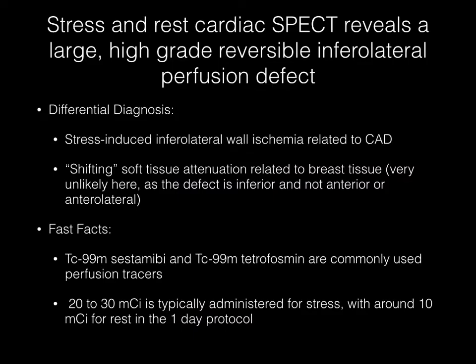Stress and rest cardiac SPECT reveals a large, high-grade, reversible inferolateral perfusion defect. Your differential diagnosis should include stress-induced inferolateral wall ischemia related to CAD. A less likely diagnosis would be shifting soft tissue attenuation related to breast tissue. Here, the defect is inferior and not anterior or anterolateral, so again, this is very unlikely.